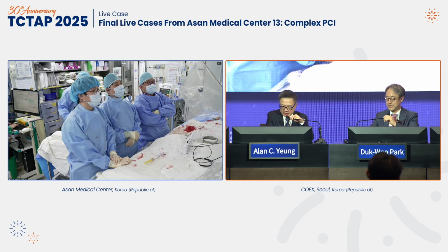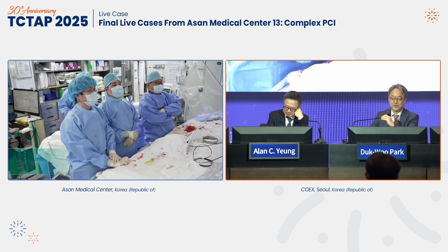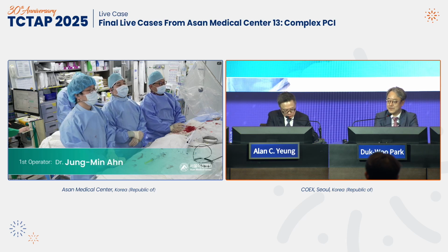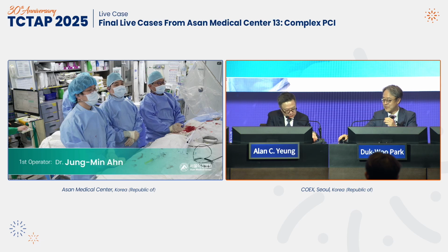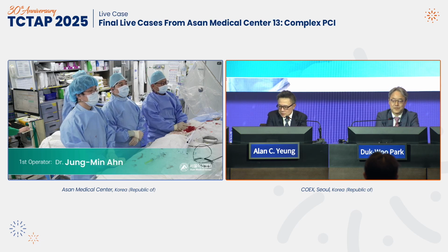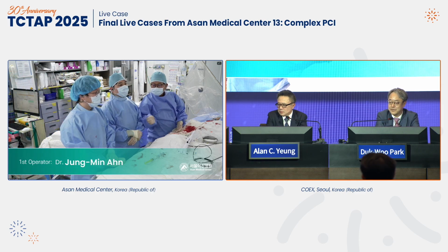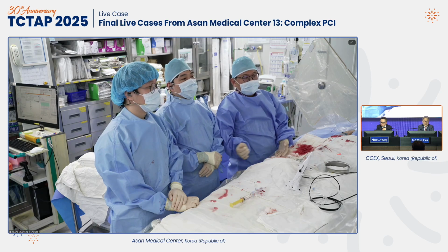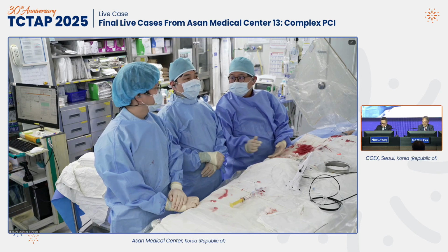Hi, Jung-Min. This is Alan. Welcome to the final session. Hi, Alan and Duk-Woo. This is actually the final session of the live demonstration. So we prepared a very complex left main and diagonal bifurcation disease, very complex cases. I'd like to introduce my team, Dr. Baek. So we'll introduce the patient with brief history.